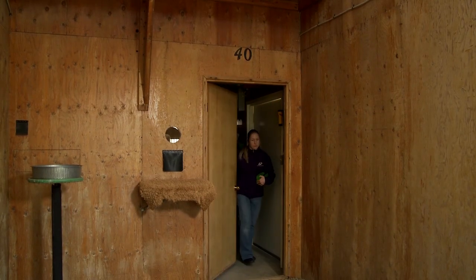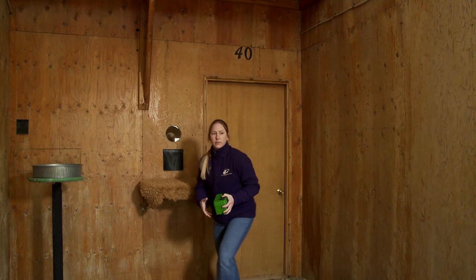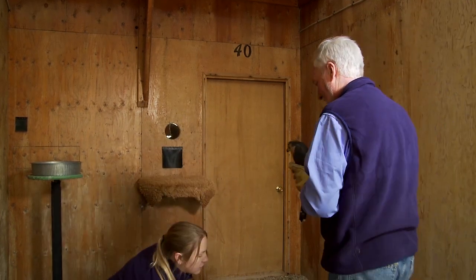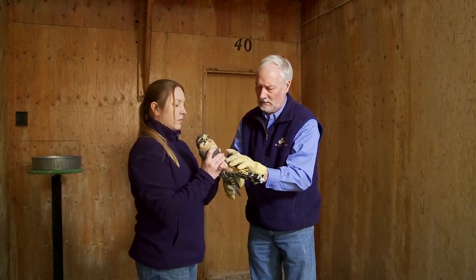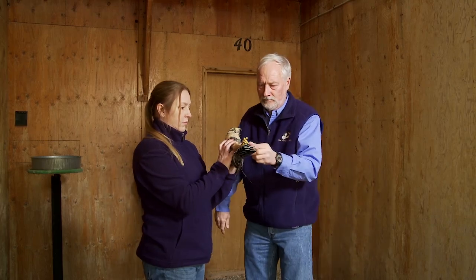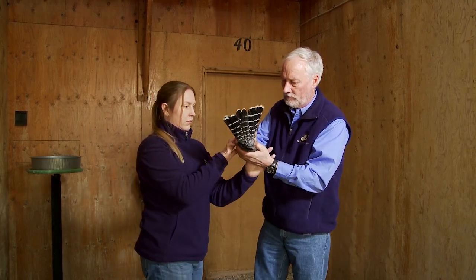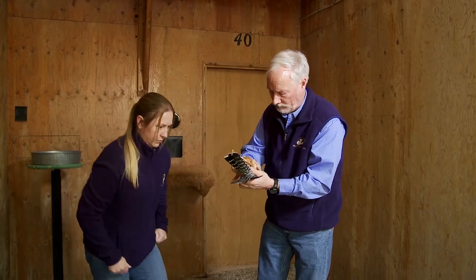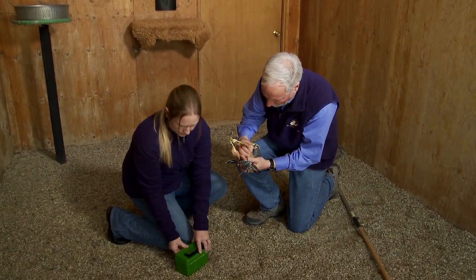After Cal captures the female, Heather comes into the chamber with the semen. Heather casts the female and holds the falcon, breast up and tail pointing away. Cal then holds the feet and places the palm of his hand on the breast with his 3 middle fingers between the legs. Cal can control both feet with his thumb and little finger.